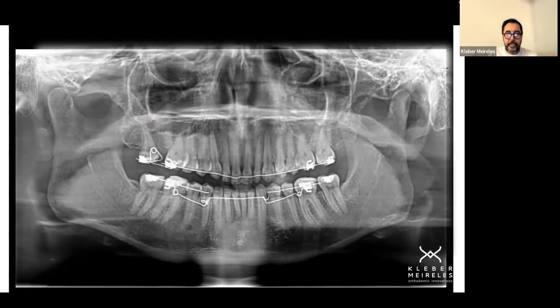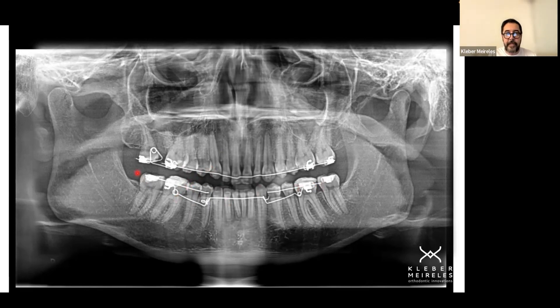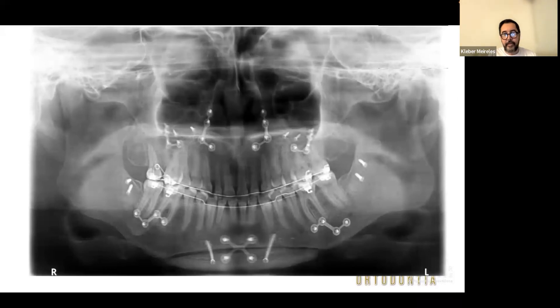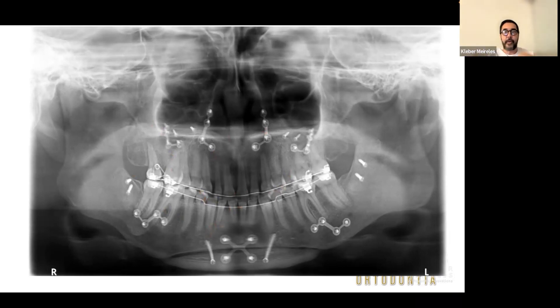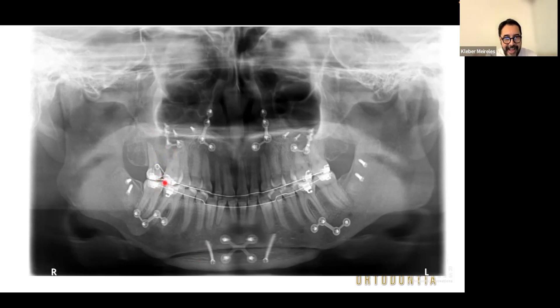Going on, we see that in this phase of treatment we were using this approach to do the leveling of the curve of Spee using the three-piece arch, and now we have it today. This is the x-ray we did today — we are now comparing after surgery. This is not my request; this is from the surgeon's side. We are now dealing with the uprighting of this root. After closing the space, we still have the moment of the couple acting on this molar to do the uprighting, and it's going to happen in a few more months.